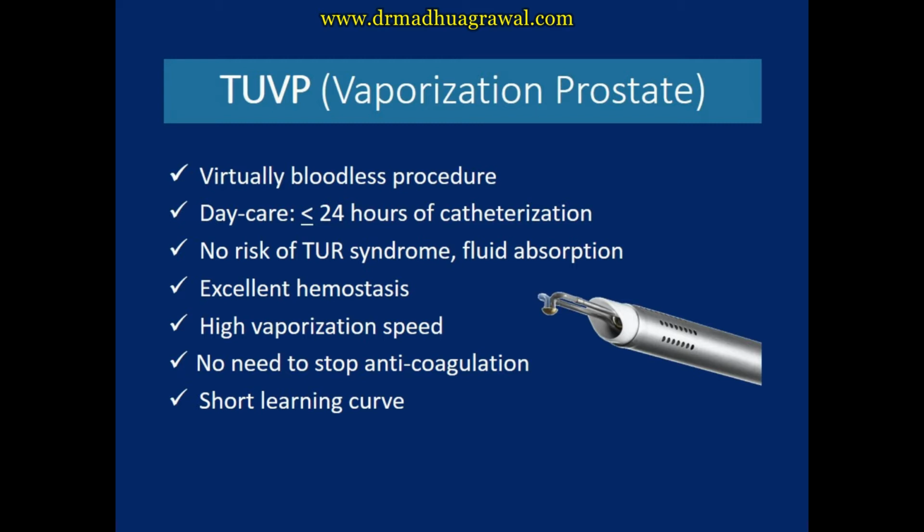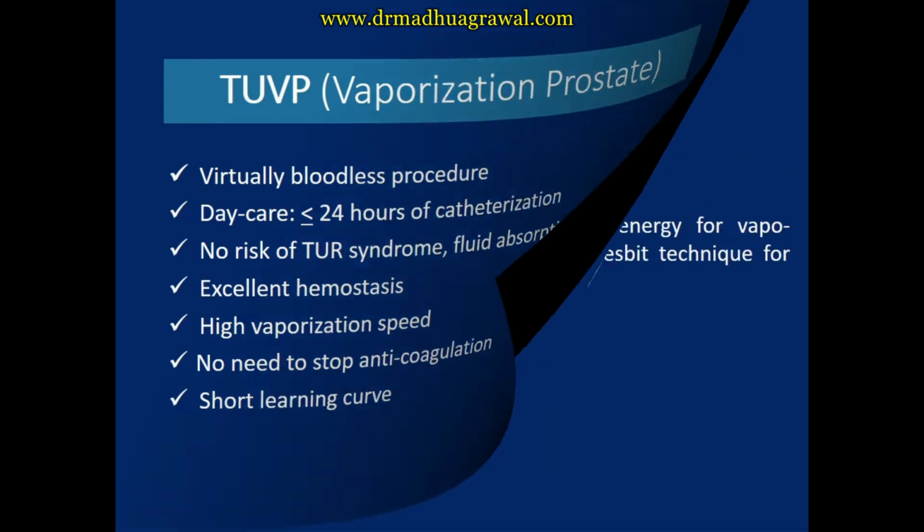This is a virtually bloodless procedure with catheterization times of less than 24 hours and excellent hemostasis. There is no need to stop anticoagulants, and the learning curve is flat as it closely mimics monopolar transurethral resection.